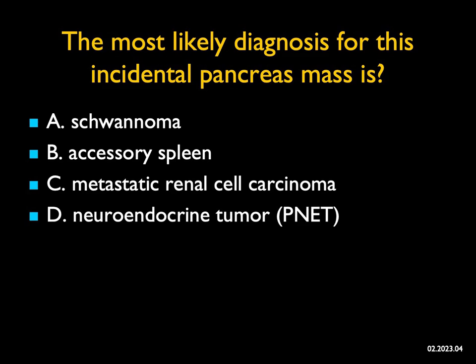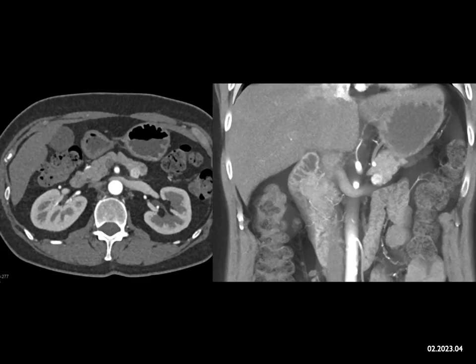The most likely diagnosis for this incidental pancreatic mass is — well, what am I looking at? I'm looking at a one-centimeter mass in the posterior body of the pancreas, near the body-tail junction. Schwannomas are usually low density, well-defined, and not vascular, so that's not it. It could be an accessory spleen, but it really looks like part of the patient's pancreas — accessory spleens are closer to the tail, and this is in the body. When you look at the epicenter, it's really a pancreatic mass, not a great fooler like an accessory spleen.